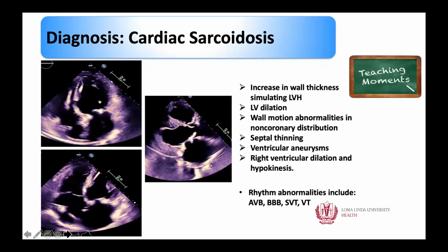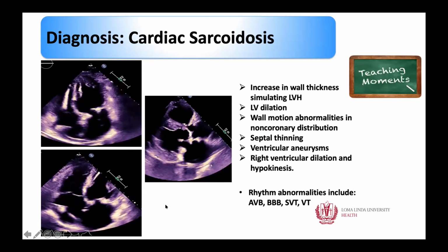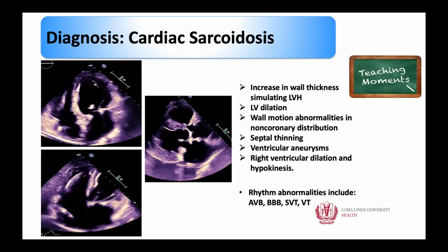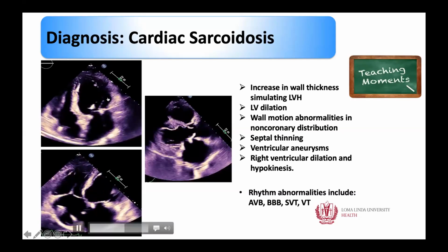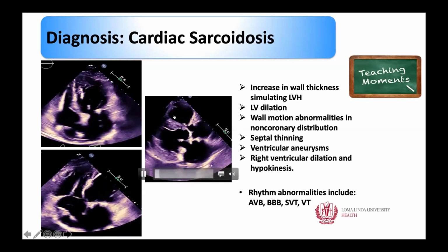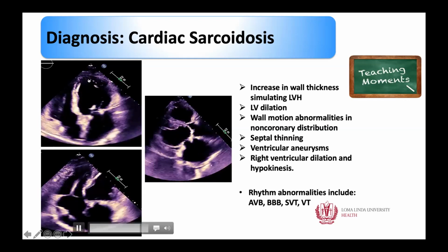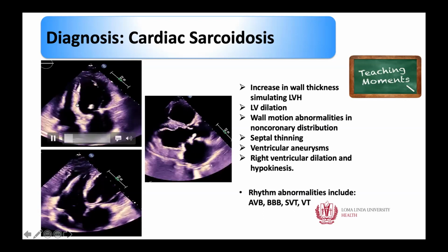So let's go and speak about cardiac sarcoidosis. So cardiac sarcoidosis, the echo findings, if we look at it, there is, of course, increase in the LV thickness that simulates the LVH. There is LV dilatation. There may be wall motion abnormality that does not correspond to the coronary distribution. So the typical thing that you would see in these patients is the septal thinning. You will have ventricular aneurysm, like in this patient, the basal septum is quite thinned and aneurysmal, and then the right ventricular dilatation and hypokinesis.